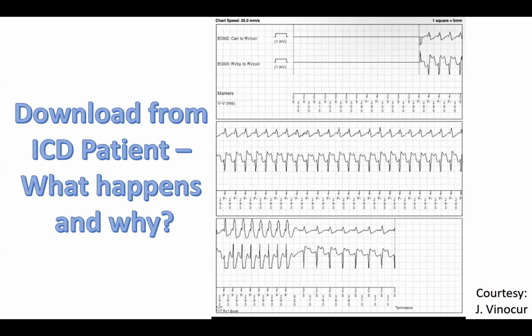But one of the things that became popular was anti-tachycardia pacing. And I remember one time during defibrillation testing, we decided to see if the anti-tachycardia pacing would work in a patient, because they had a lot of tachycardia that was monomorphic. And there was a hope that rather than getting shocked, maybe this patient would have pace termination of his arrhythmia. And what happened during the testing was that the pacing slowed the VT to a rate that was below the detection zone, but it didn't stop it.